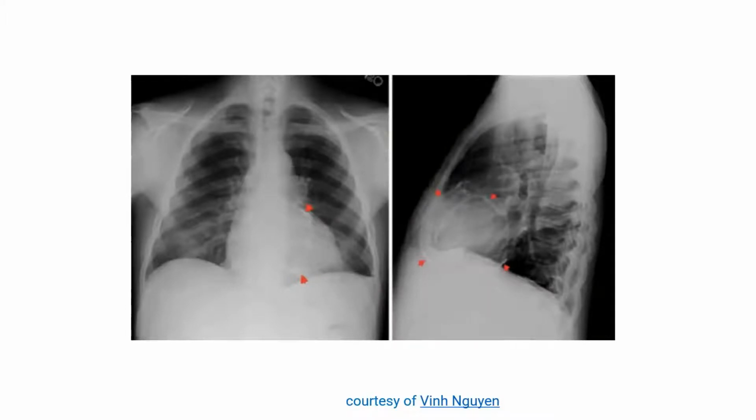I think CT scan. Okay, good. CT scan, why? I'm not sure, but I think it can give you a score about the degree of calcification. To confirm a calcification. The diagnostic tool is the best ever in terms of calcification. It is the cardiac CT.